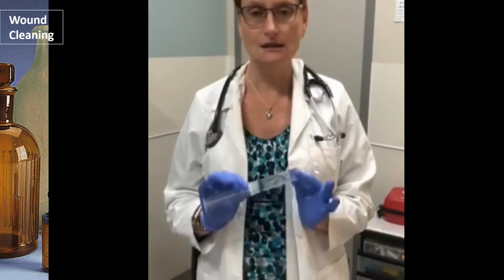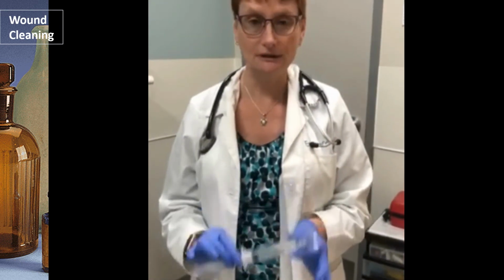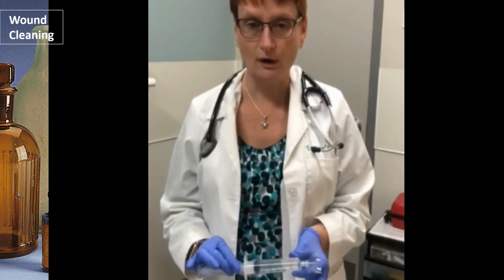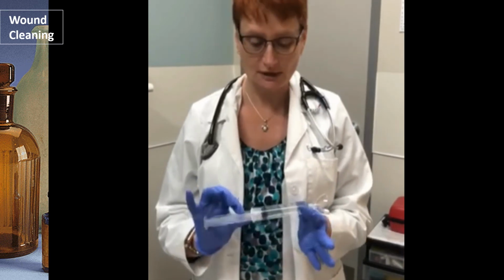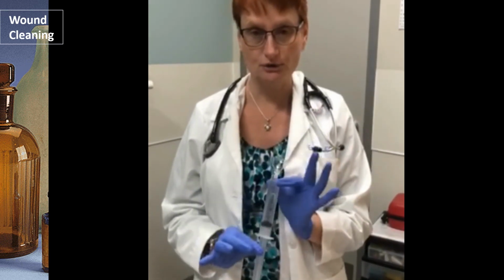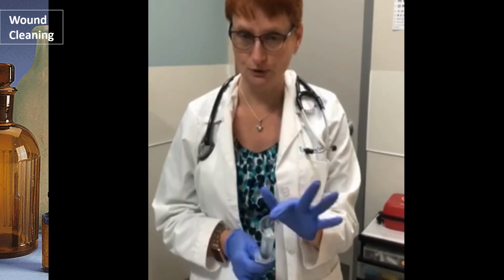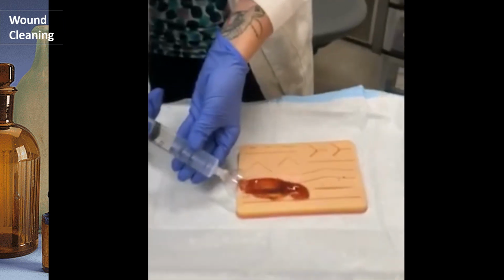Wound cleansing is all about irrigation. We want to decrease that bacterial load, and the best way, per literature, is to irrigate. You can use normal saline, you can use tap water. Literature and evidence-based practice says that you can use both. So I've just drawn up regular tap water in a large bore syringe. Don't forget your guide, splashback is an issue, all right? So we're just going to take this and clean. You want to clean away from you.